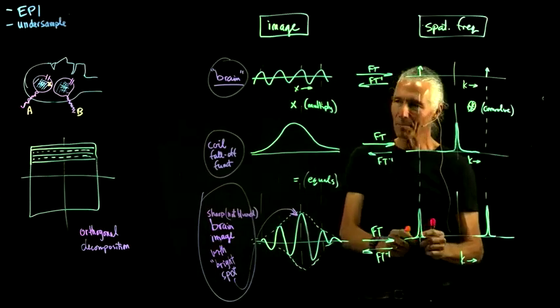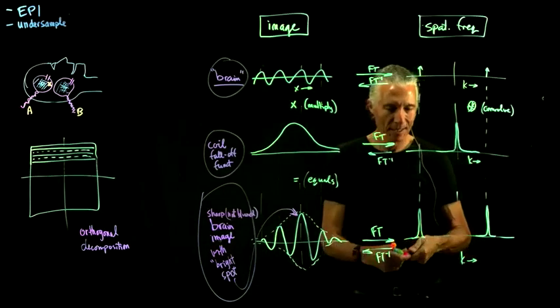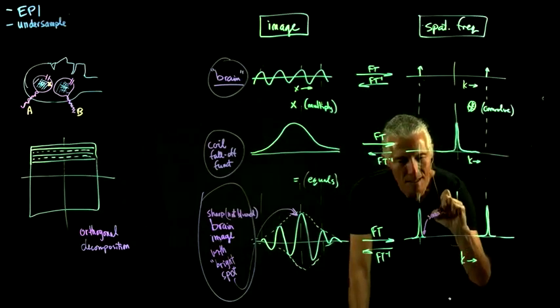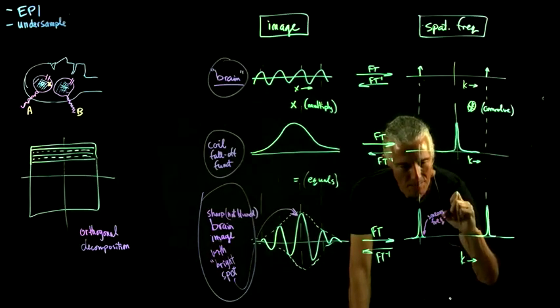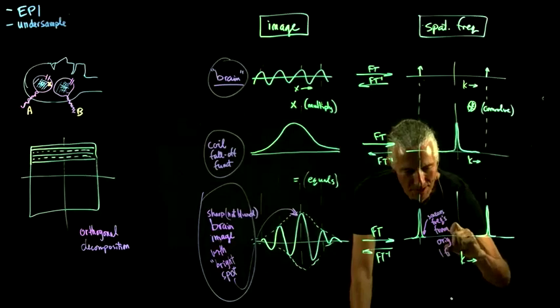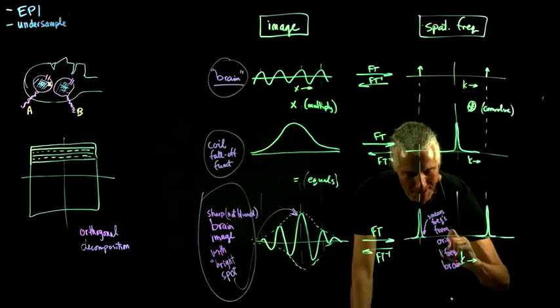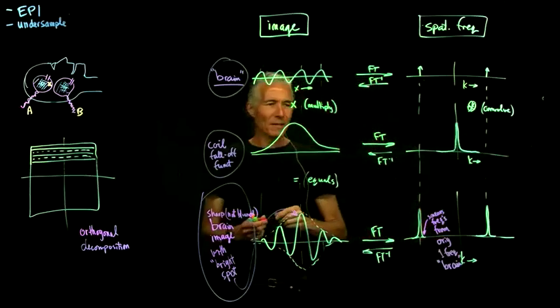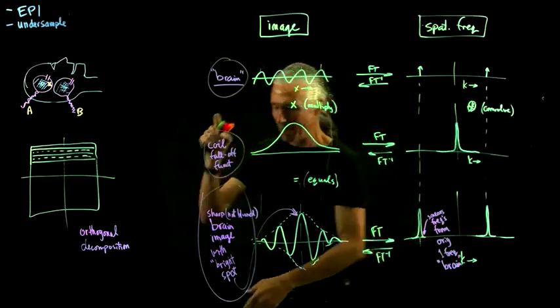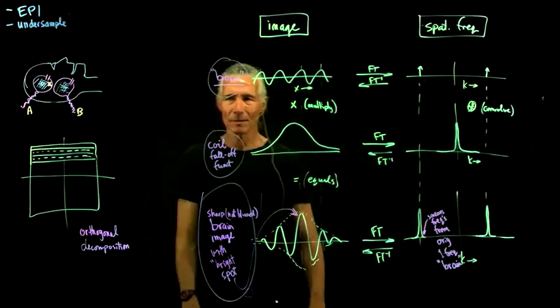But what have we done in K-space? We kind of smeared out the data. It smears frequencies from the original one-frequency brain. So we had our stupid brain that only has one spatial frequency in it over here, and so we kind of smeared it out into the adjoining frequencies, adjoining spatial frequencies.